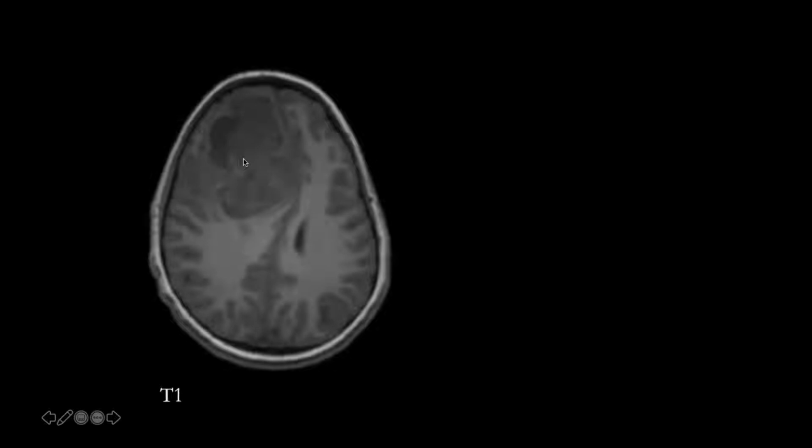Now, what is the point? Why is this case so peculiar? Because while we're seeing a very aggressive and very big lesion on MRI, we can also see that we have very smooth borders around and no infiltration of the tumor. And also the mass is very superficial. So basically this patient is doing very well. Although the prognosis of this patient was expected to be very bad, actually this patient after 3 years and 6 months is still alive without recurrence of the tumor.